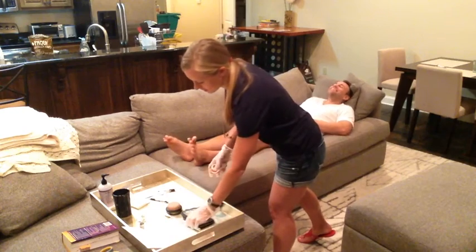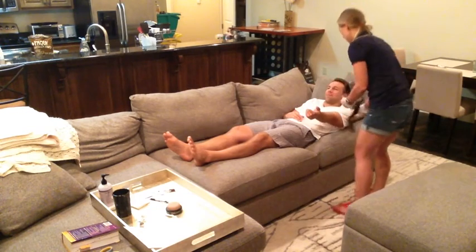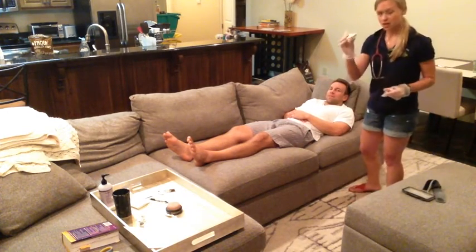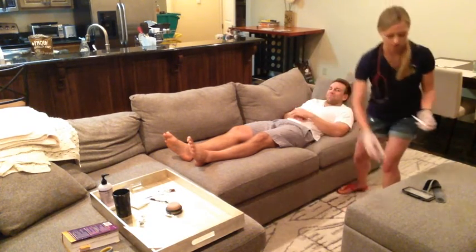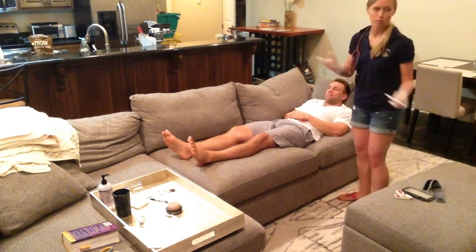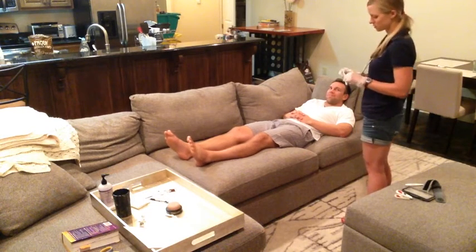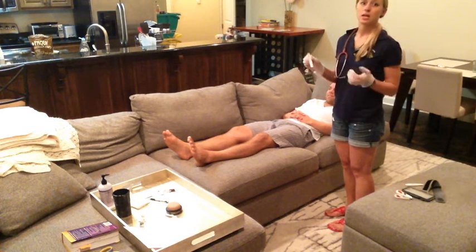All right, next we would do our vitals. So I have my handy dandy blood pressure cuff here. We would put the blood pressure cuff on, take the blood pressure, and we would do pulse ox. Can I have your finger, please? Pulse ox. Thank you. Take temperature. Temperature. All right. We would record all the findings, of course. And then could you please rate your pain on a scale of 0 to 10 for me? 0. Thank you.